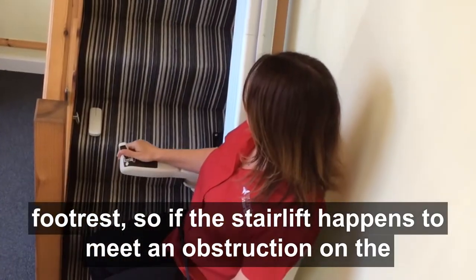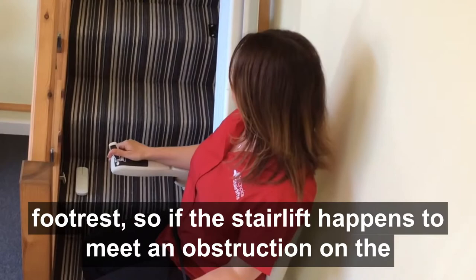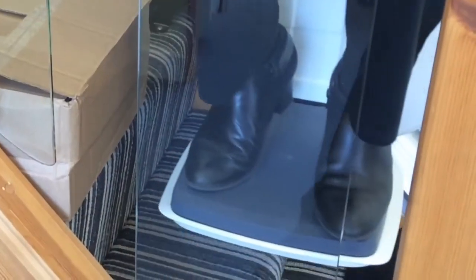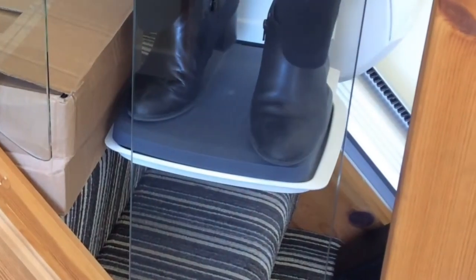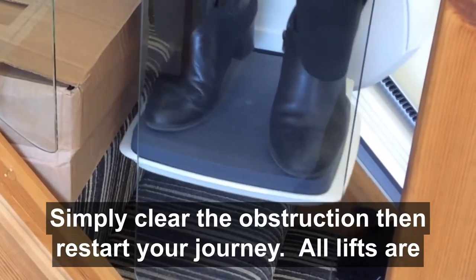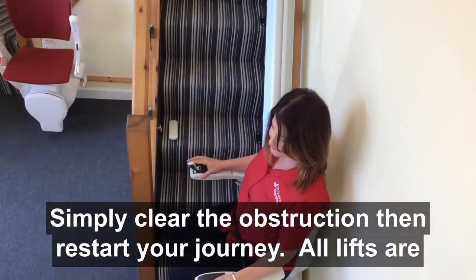If the stairlift happens to meet an obstruction on the stairs, the stairlift will automatically stop. Simply clear the obstruction and restart your journey.